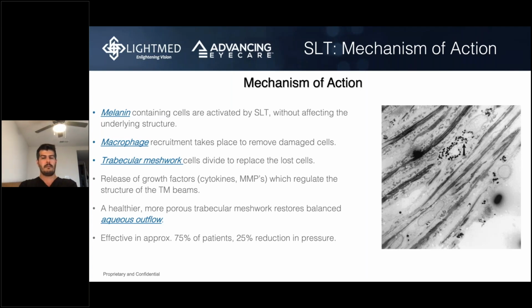With that said, do you have a post-treatment follow-up protocol, and how far apart do you space treatment on one patient? So the second question, I usually space them a week or 2. I just want to make sure that if it has any IOP spike or any blurring or light sensitivity, it goes away before we treat the second eye, and it practically ends up being a week or 2.